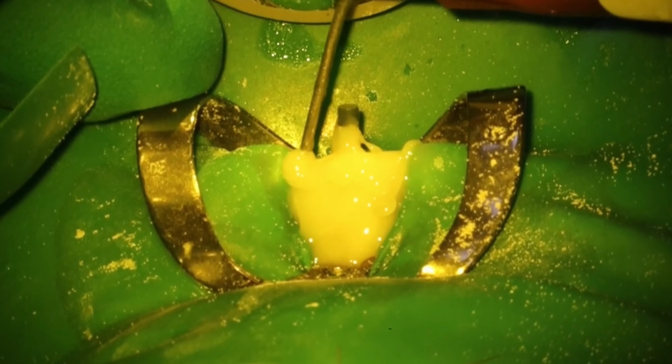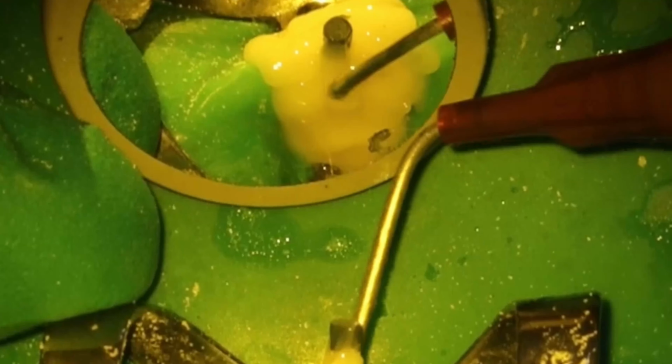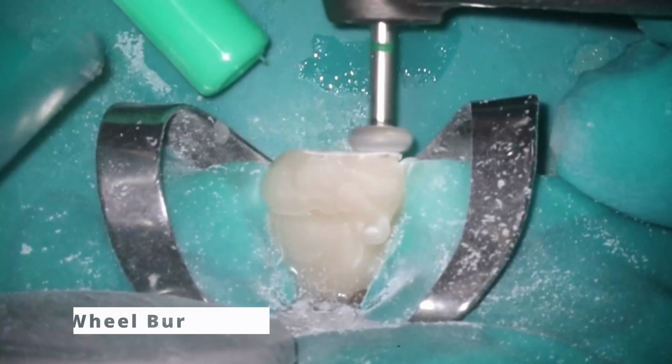I ended up not curing this one in between. Sometimes I'll cure halfway through, sometimes not. I find that if you can add more composite while it's still in the liquid form like this, it all combines much better. And if you try to do it where you light cure and then fill on top of there, it just doesn't seem to work as well. So anyway, that's what it looks like. So already looks like a nice tooth.